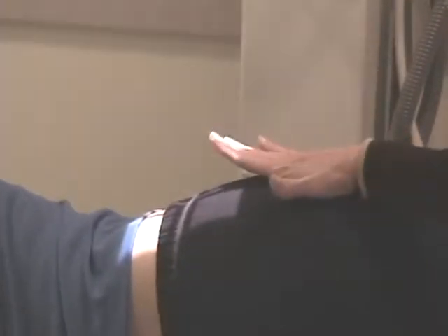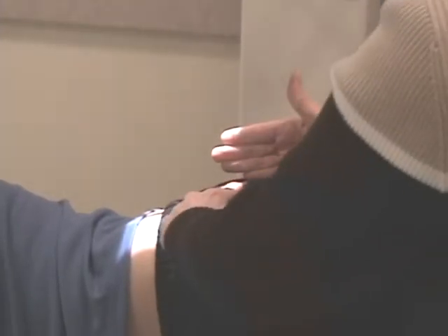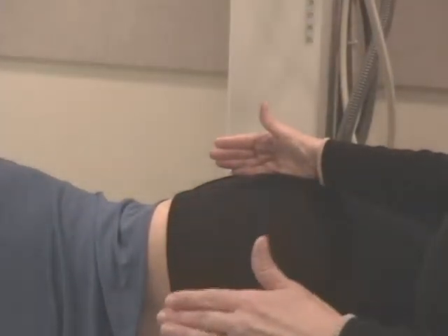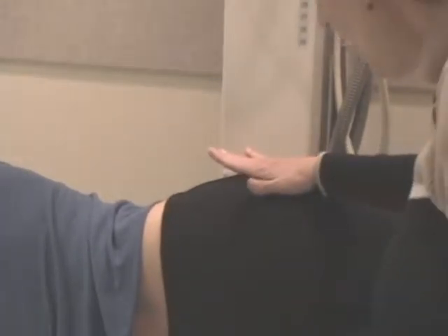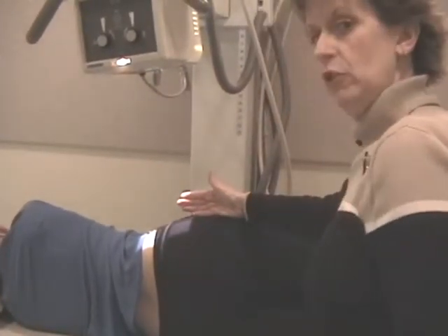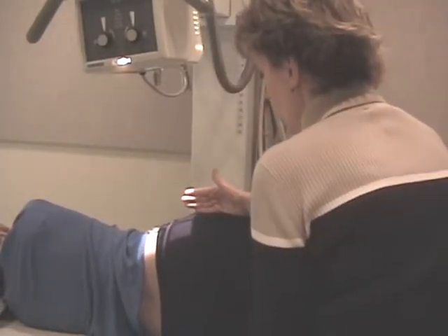I went with the flat hand, and I'm feeling for the trochanter. And I pivoted my hand up on the trochanter. And can you see this crosshair here? It's slightly behind my hand. I'm happy with that relationship. L5-S1. When we look at x-rays, you'll be able to see that the L5-S1 area is slightly behind the level of the trochanter. So if you feel the patient's trochanter, identify it, and you're slightly behind that, you've double-checked yourself and you should be okay. I might consider moving my patient just a fraction of an inch forward.